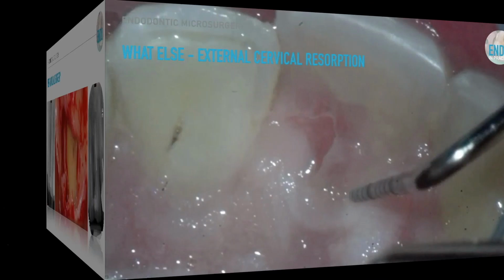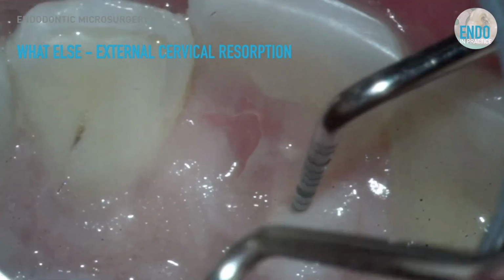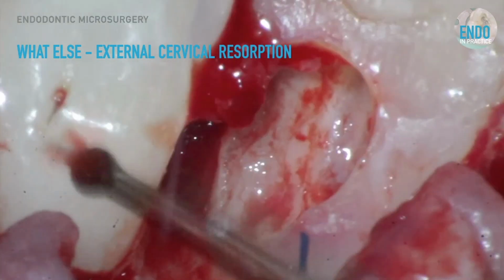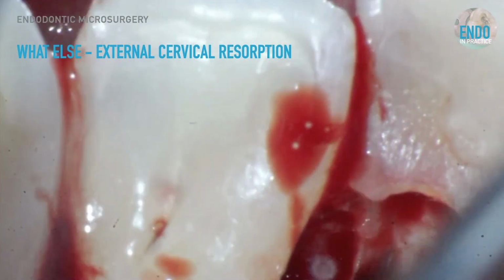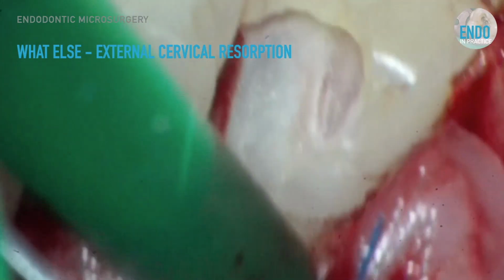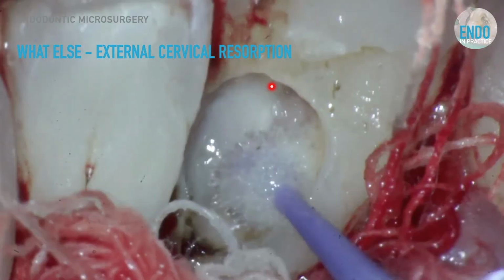And finally, if you're interested, I did a lecture recently on this for dental traumatology. This is external cervical resorption. We see quite a lot of external cervical resorption. I've seen about 81, exactly 81, over the last 2 years, because that's what we've put in for publication. In external cervical resorption, the gingiva essentially invades the tooth itself, nibbles away at the tooth, and leaves this hollow. But you can just about see some dentine protecting the pulp, so that's great.